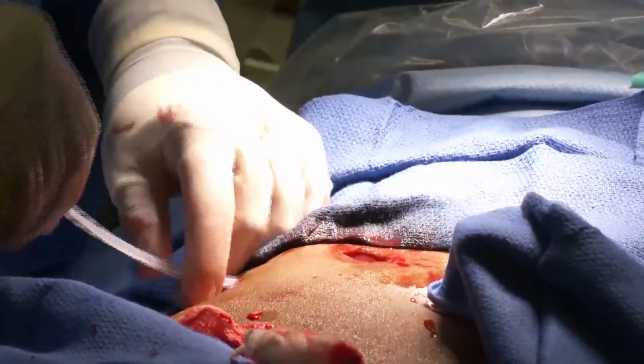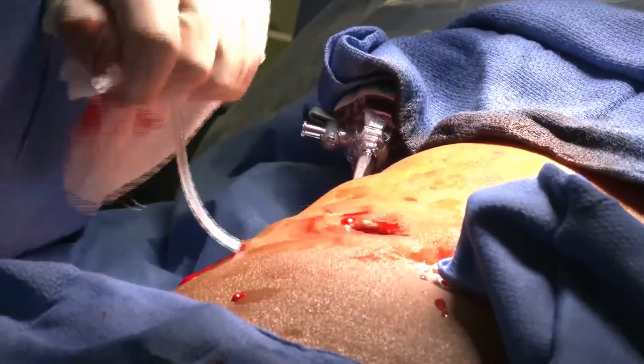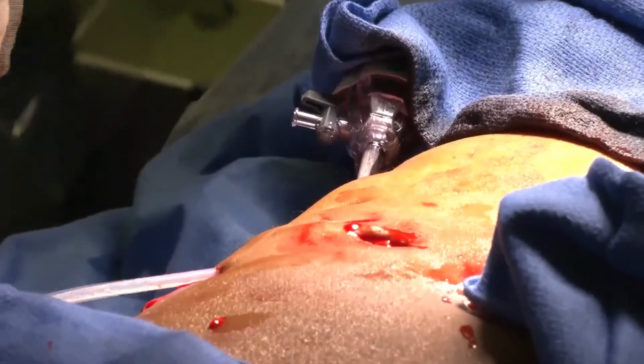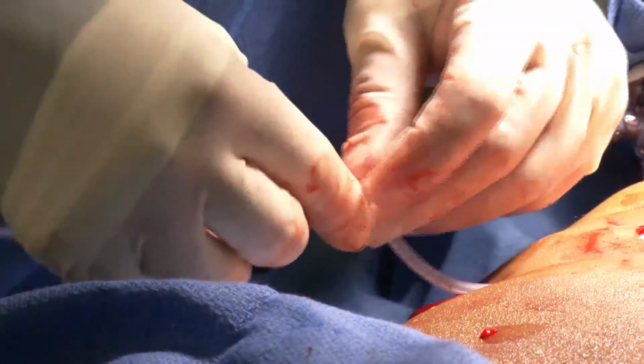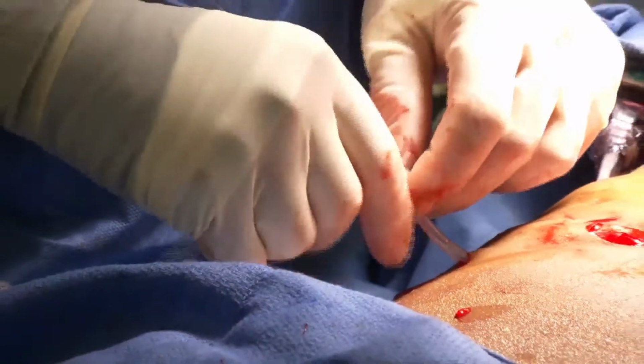And we'll remove the trocar, smooth out the catheter, and then we're going to place a saline syringe here and inject and make sure there's no resistance to flow that would suggest a kink.